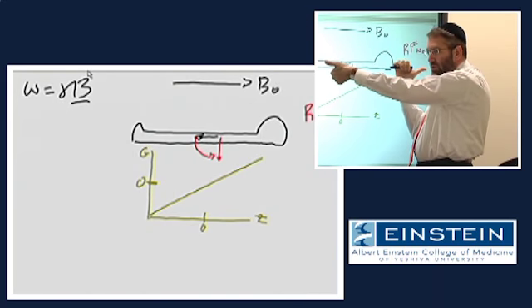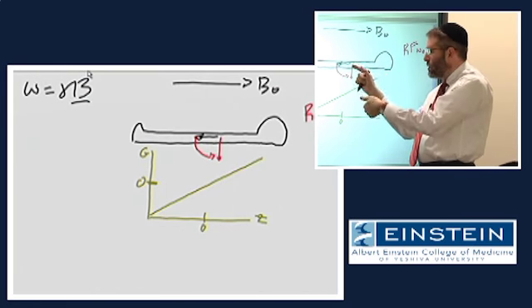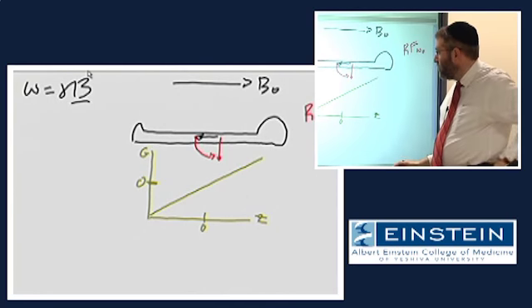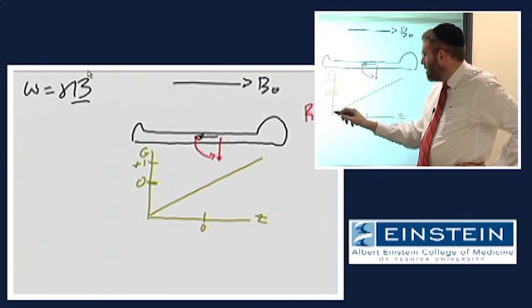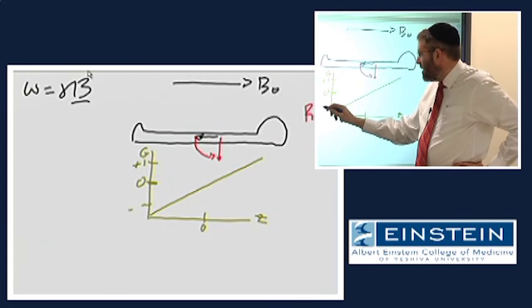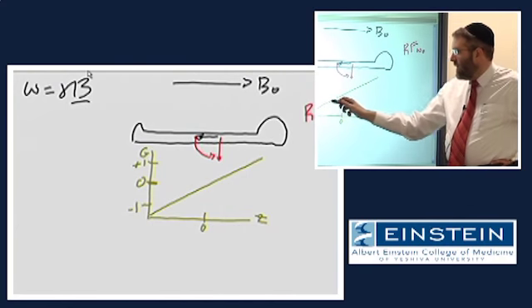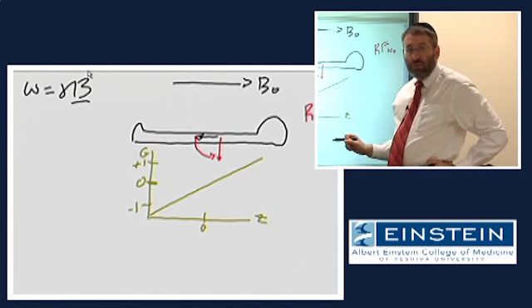So those vectors become smaller and smaller as you get to isocenter, at which point they are equal and opposite and essentially cancel out. So what we actually have is a range of gradient strength, which is negative and positive, depending on which side of isocenter we are on.